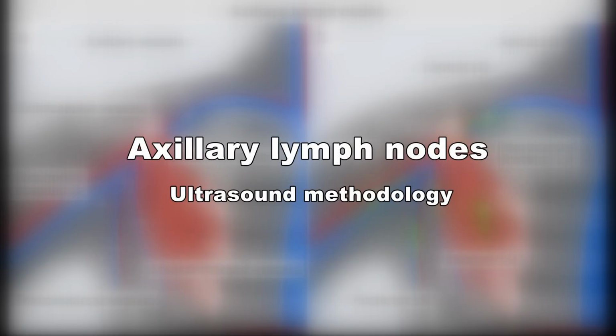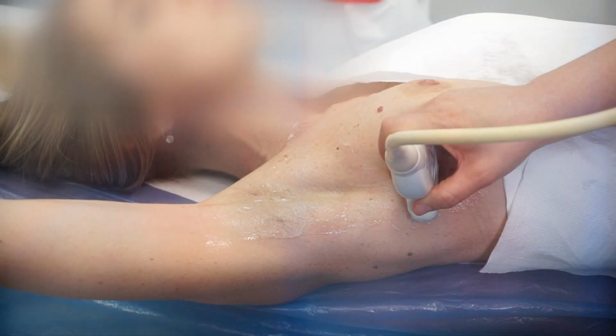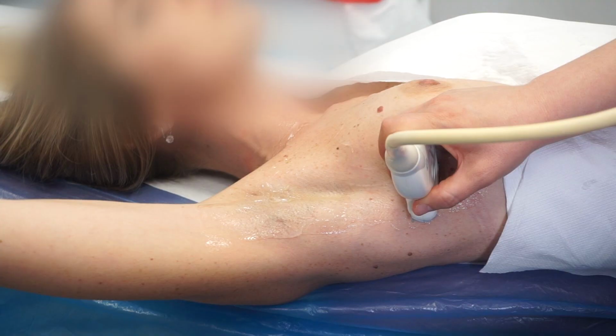This video demonstrates the ultrasound methodology of lymph node assessment of the axillary region. The patient lies in a supine position, with the arm abducted and externally rotated. The proper probe placement is shown.